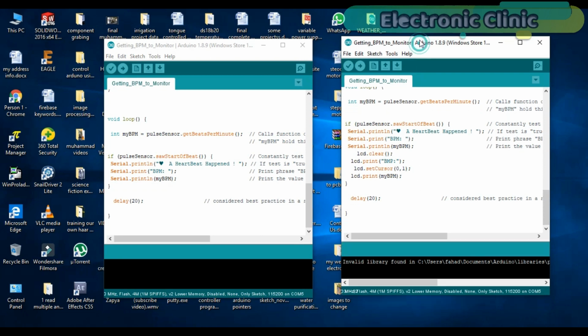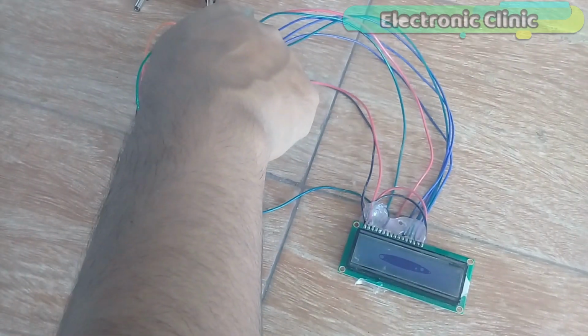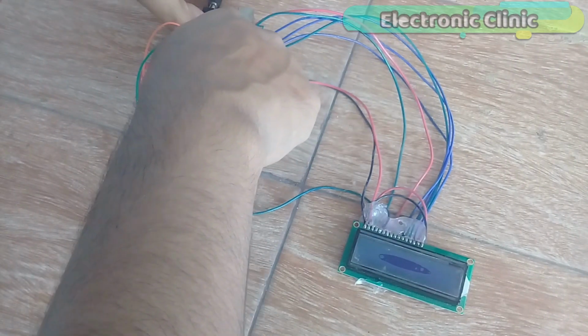This code can be downloaded from my website. I have already uploaded this program. Let's watch this project in action. All the components are interfaced as per the circuit diagram. First of all, power up the Arduino.